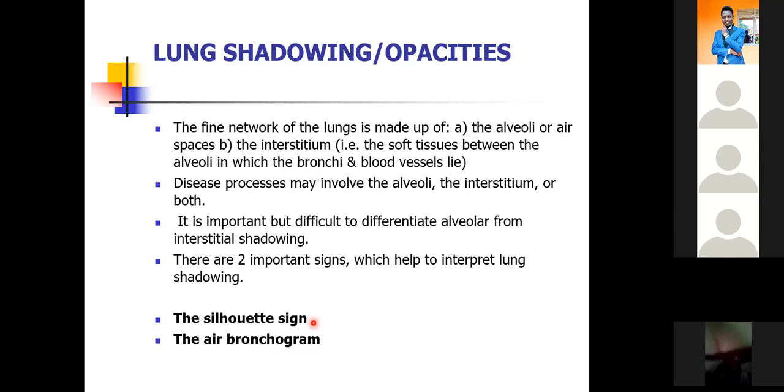So there are those that will result in opacities, or those that will increase the blackness of the lung tissues. For this particular session, we are going to focus on those that will result in lung opacities.